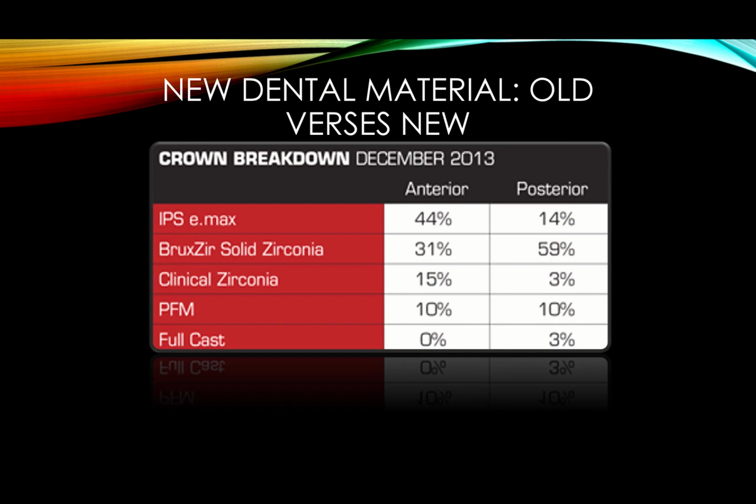You're talking about 5 times more strength. Same thing for zirconia. Zirconia is strong, but once you use it as a core and you layer on top of it, that layer of feldspathic porcelain that you layered on top of the core is not strong. The core is strong, but the layer is not strong, so there is more breakage in the anterior because it's layered. Okay, that's the only explanation I can think of, the one and only.